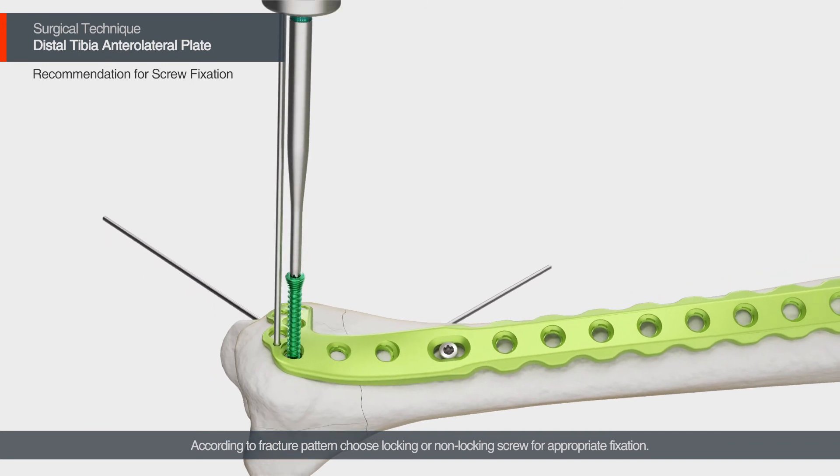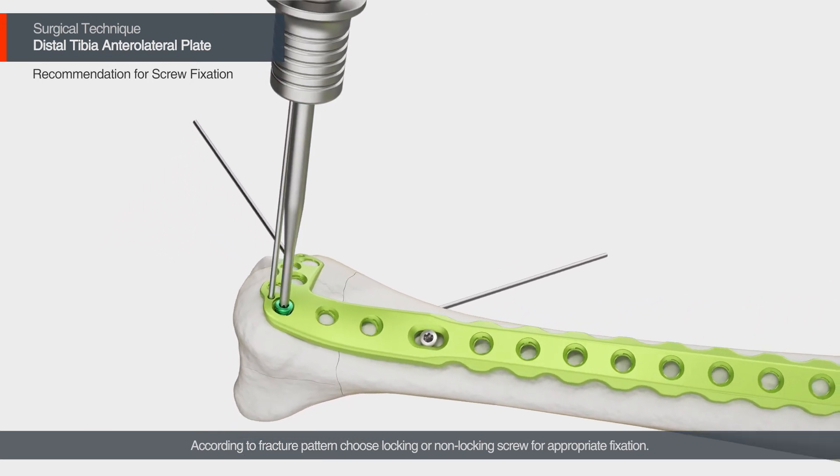According to the fracture pattern, choose a locking or non-locking screw for appropriate fixation.